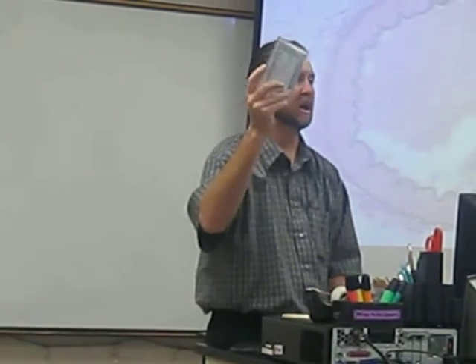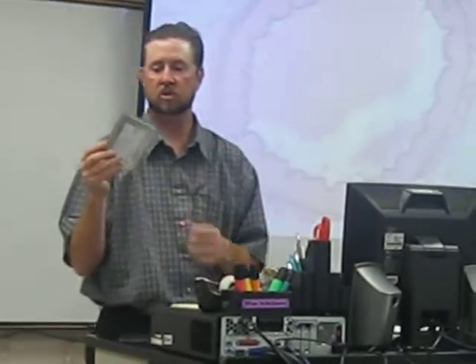Right on the inside, it goes through the procedures of exactly what you need to do. Now, on these cards, you're going to take them out of the little foil package. It's just a little flat card, and it's got 4 circles on it. 4 decent-sized circles. In each one of those circles it has a set of antibodies, antibodies that are going to be binding to proteins on your red blood cells.